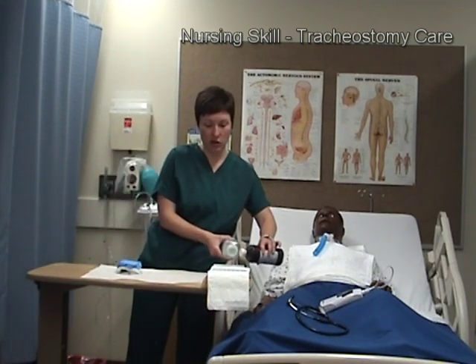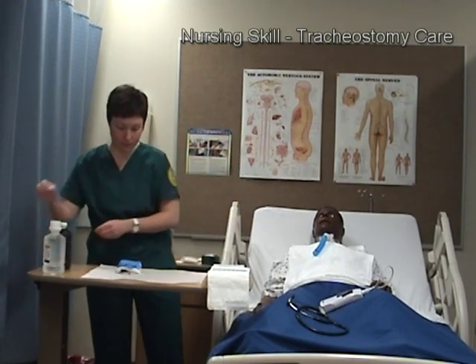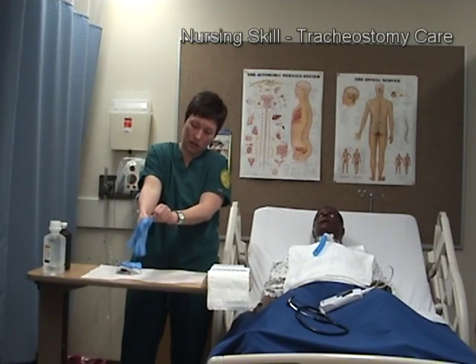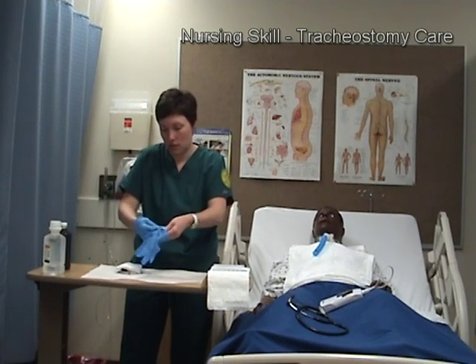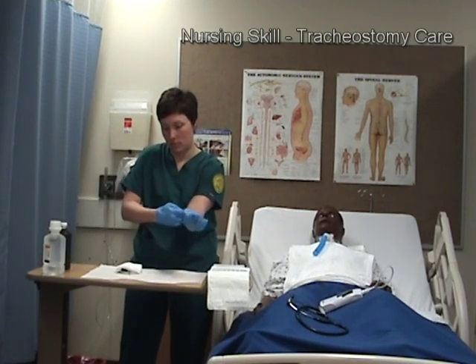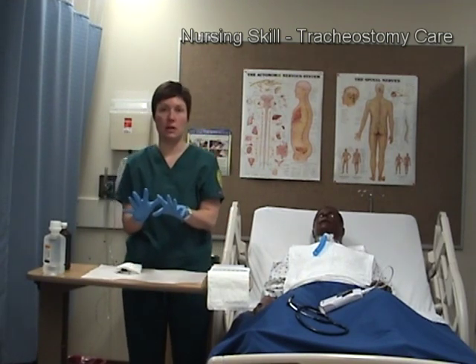I'm going to do a half-and-half mixture of hydrogen peroxide and normal saline, which will be used to soak my inner cannula. I'm also going to add normal saline in the separate tray. Next, I'm going to put on sterile gloves — these were in my kit — and make sure my fingers are fully in. I will maintain the sterility of my gloves throughout.